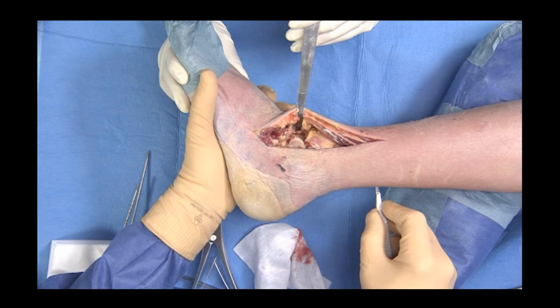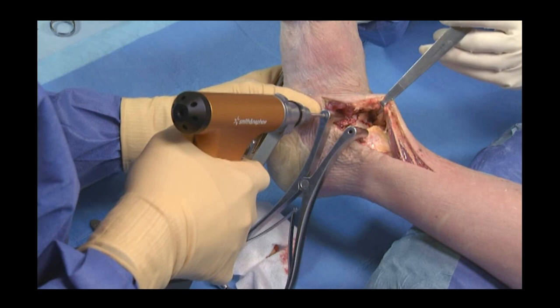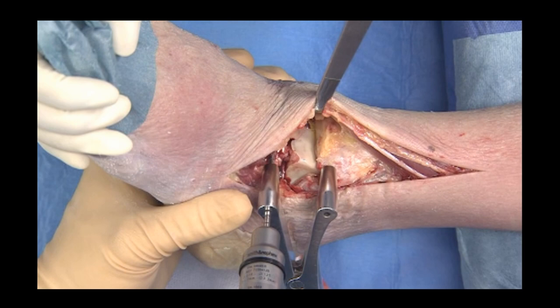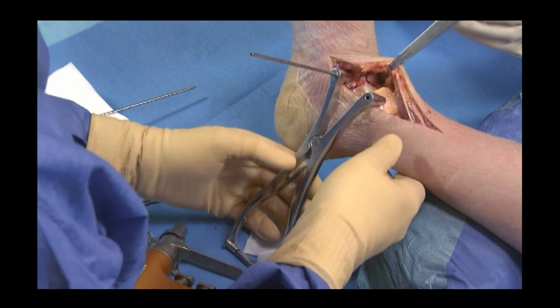Percutaneous Achilles tendon lengthening is performed to help mobilize the ankle and achieve equinus correction. Threaded 3.2 mm pins are positioned in the talus and tibia on the lateral part of the wound to help distract and prepare the joint.